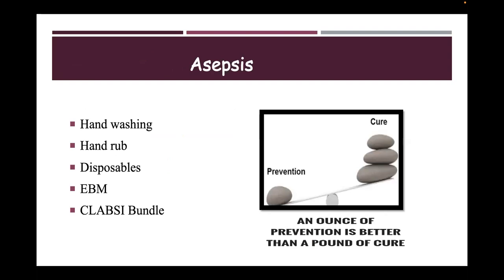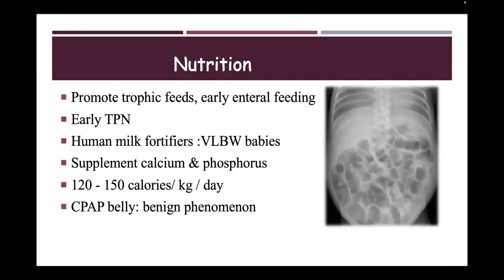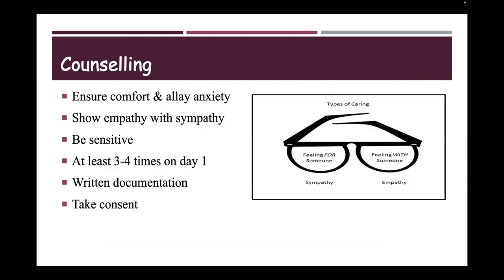Always maintain asepsis, do proper hand wash, do clustering of procedures, use disposables wherever possible, and ensure good nutrition for babies on CPAP. Remember, CPAP is not a contraindication to feeding. Babies can be on full feeds despite being on CPAP or, for that matter, ventilation.